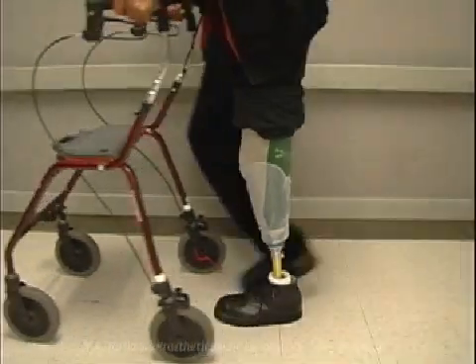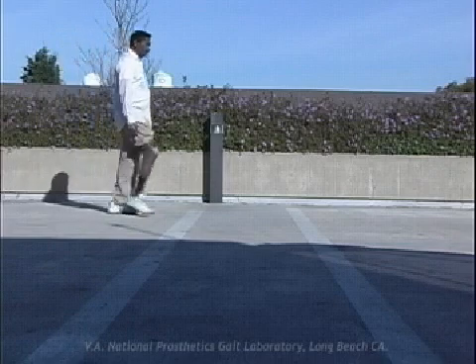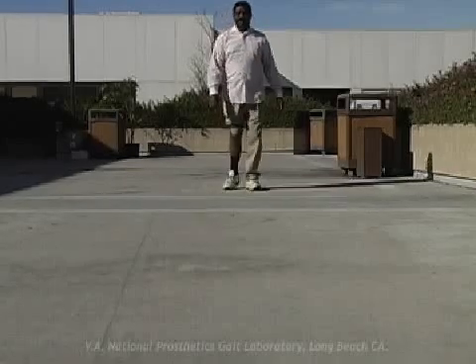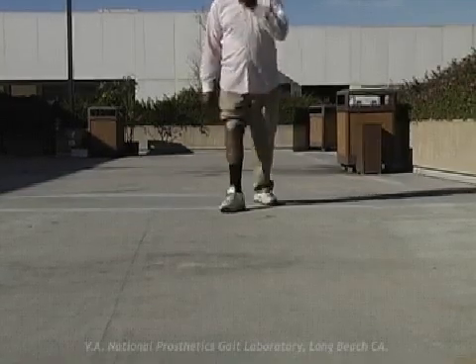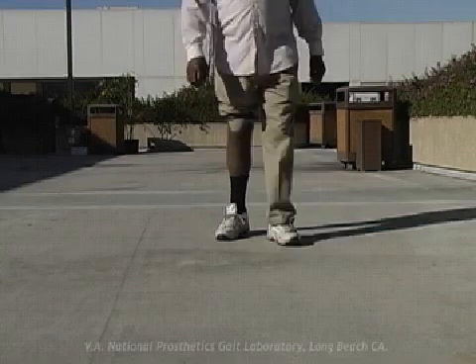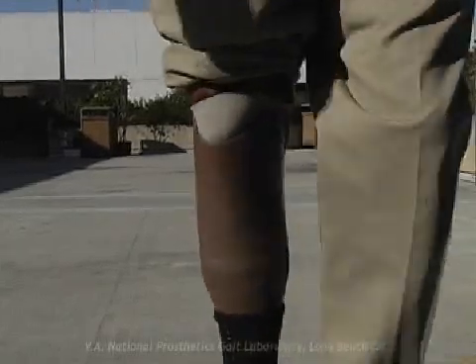This is a common occurrence among early post-operative amputees, as well as deconditioned amputees. The typical clinical observation is slow progression throughout stance phase. The knee may be seen trembling or hesitant as the individual advances over the foot. The problem can sometimes be addressed by reducing the degree of dorsiflexion and anterior translation of the socket over the foot.